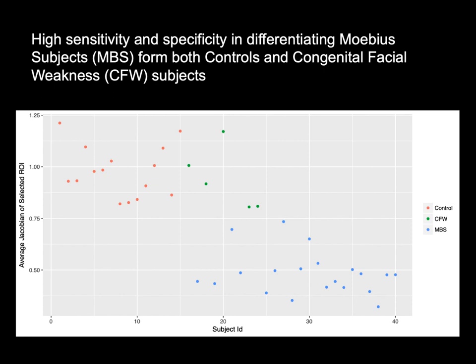So you do have a measure of variance if you're doing this across the ROI, because you start with a voxel-wise number. You do get the variance through the ROI. You can get the variance through the ROI.